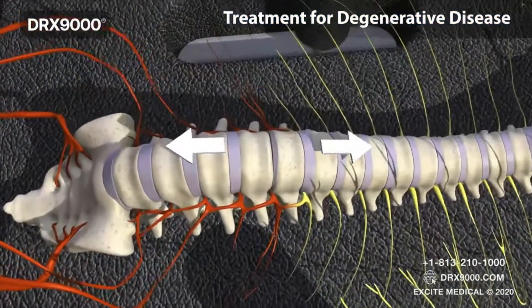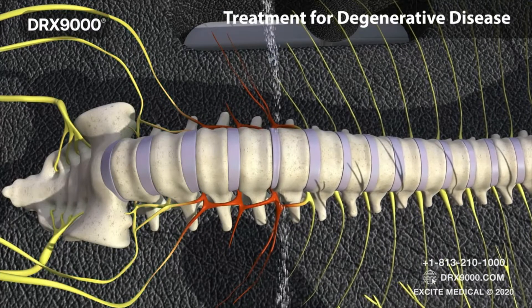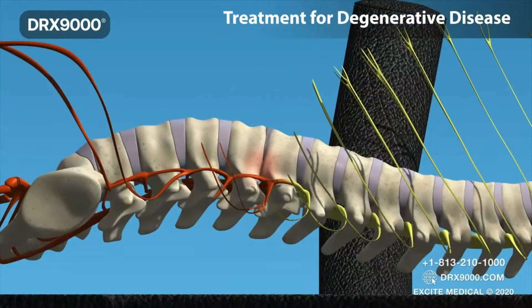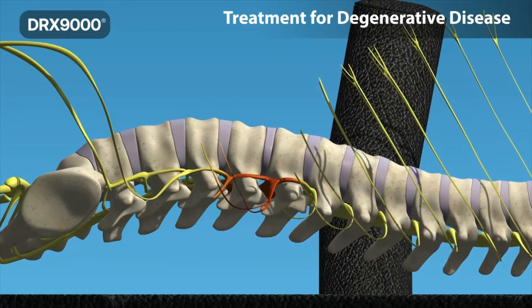During a comfortable 30-minute DRX treatment, the pressure inside the disc is dropped by more than 200 millimetres of mercury, creating a vacuum-like effect, bringing nutrients and fluids back into the disc. In the case of degenerative disc disease, nutrients and fluids are brought back into the disc, increasing the disc height.